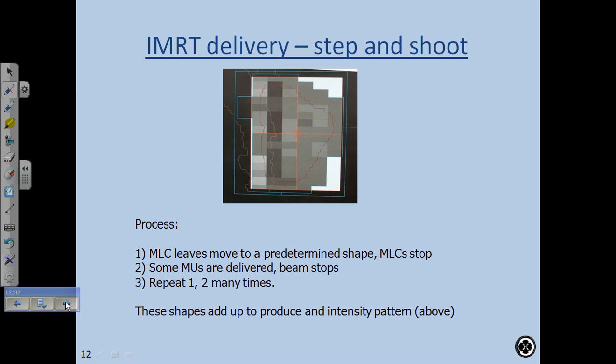It looks like a left lateral. Is that right? No, right lateral. Okay, so here's the reason I say right lateral is because I'm going to assume the head's up here and the feet are down here, and we're seeing rectum here, and we're seeing prostate here. Okay, and then this is bladder over here, out here. Okay, so this is a right lateral, and you can look at your intensity pattern.